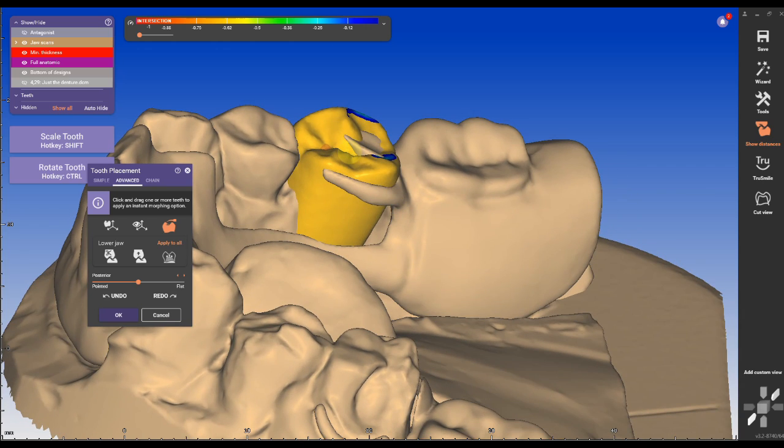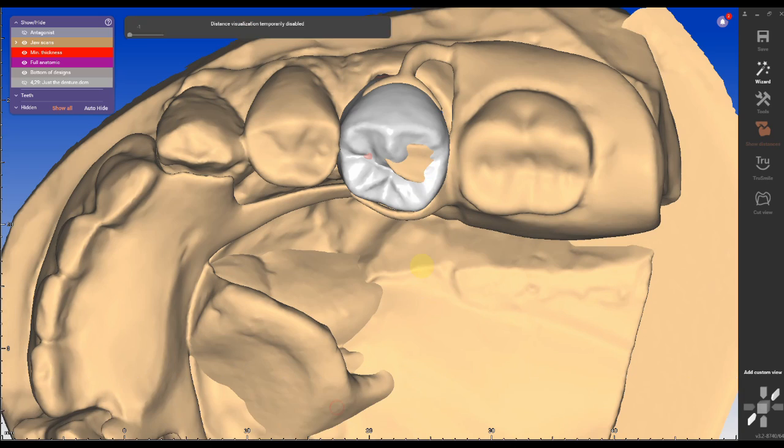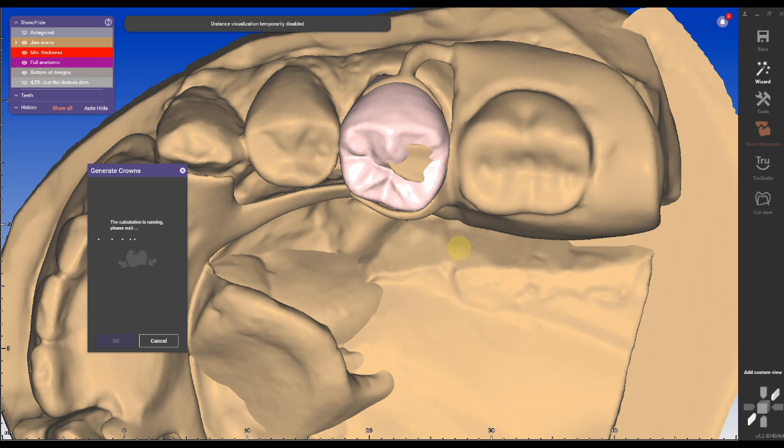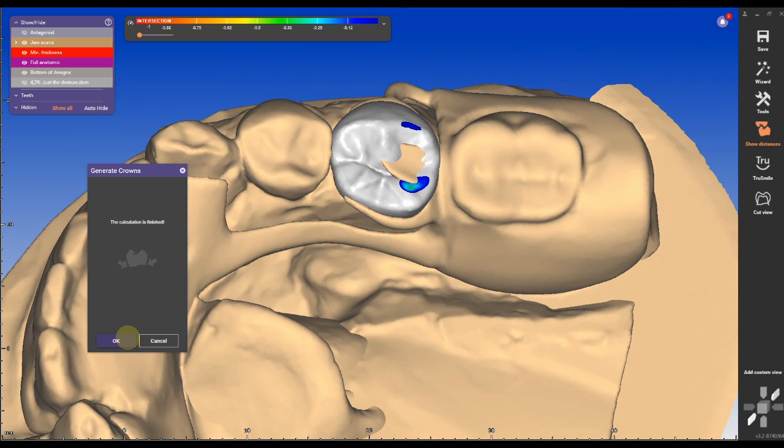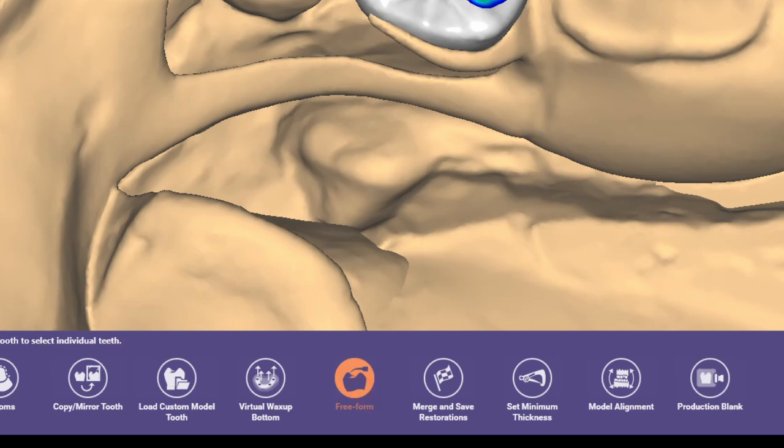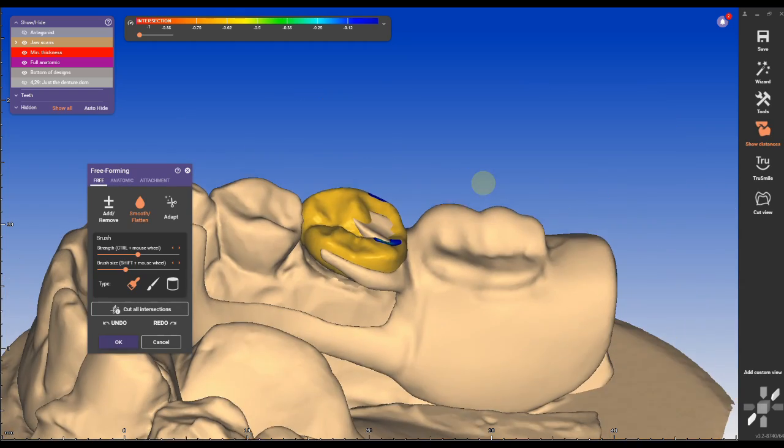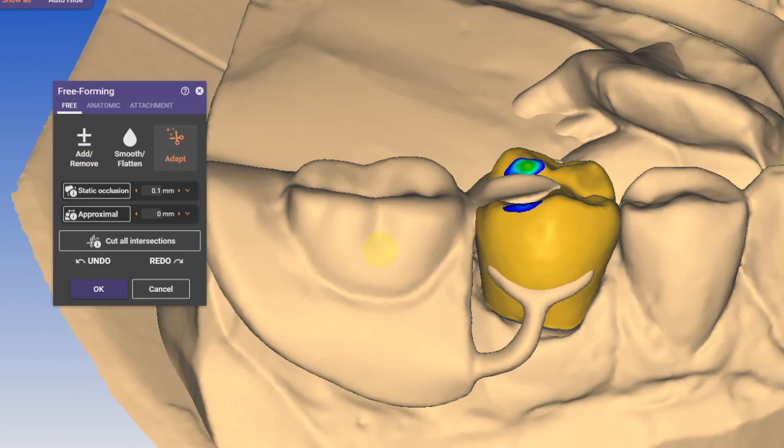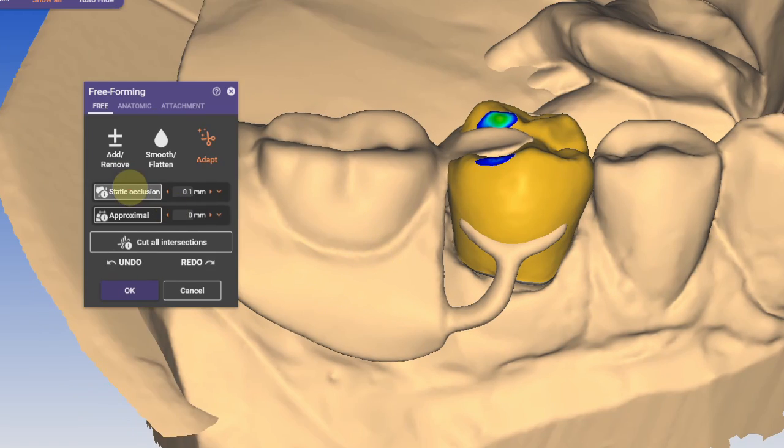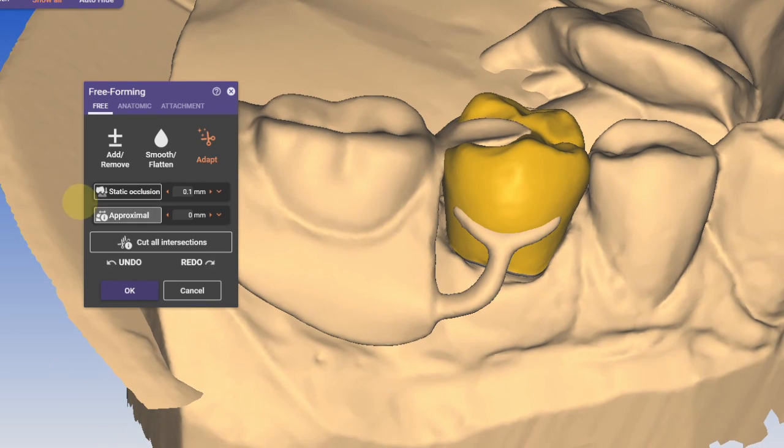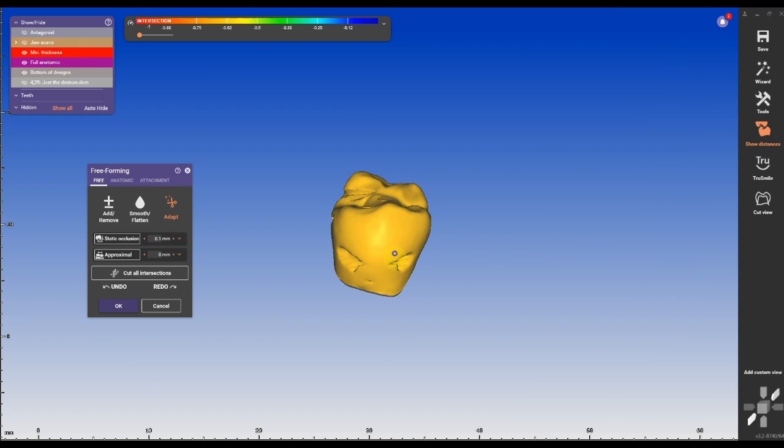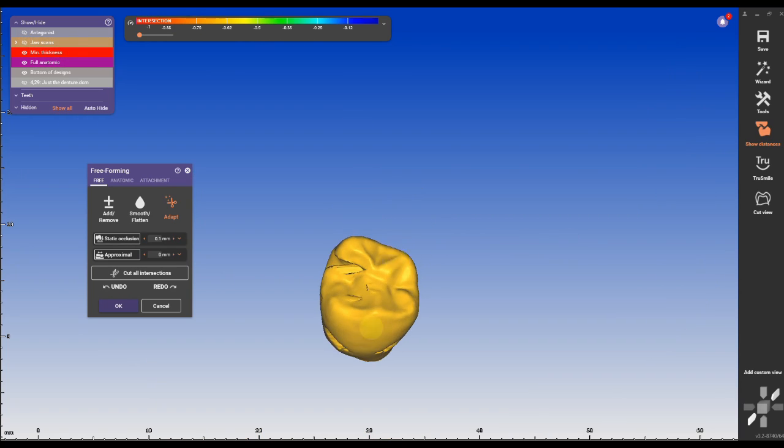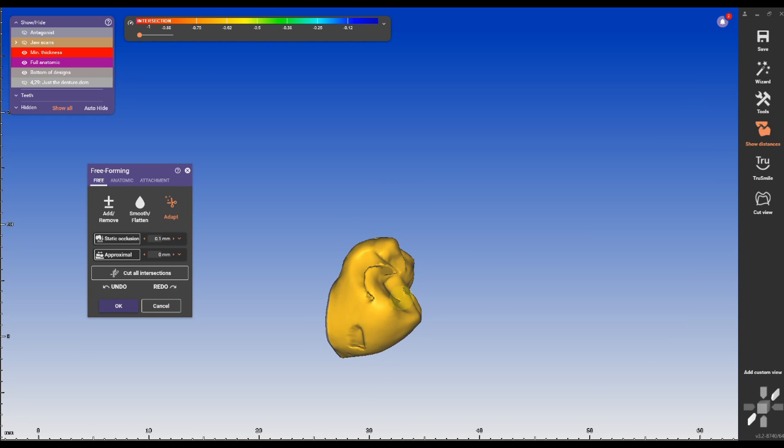I'm making sure the partial rest is fully emerged into the occlusal surface before I hit adapt in the menu. Then under freeform I'm selecting adapt and clicking on static occlusion to check the occlusion and on proximal contact to dial in the proximal contact.